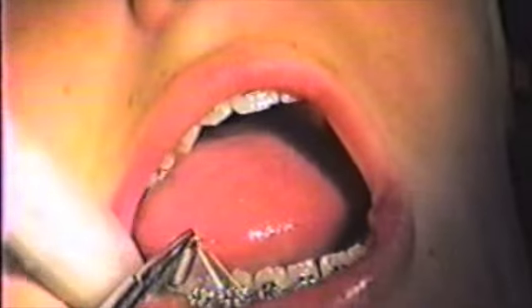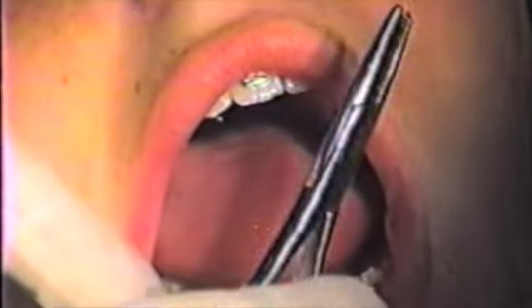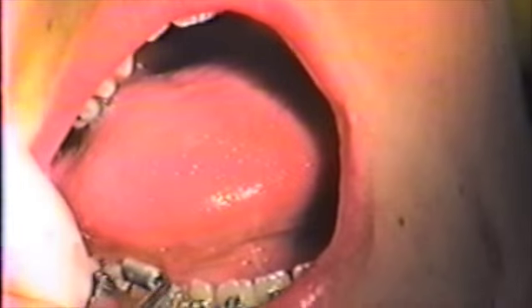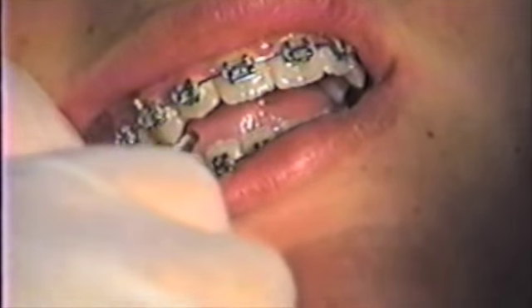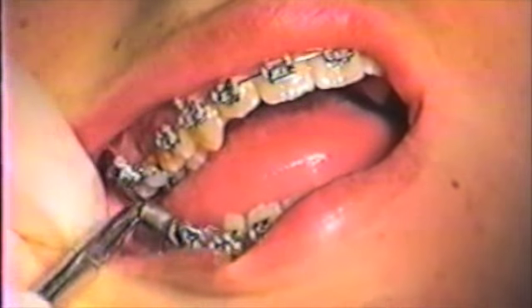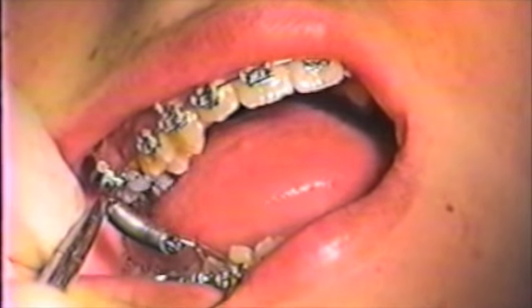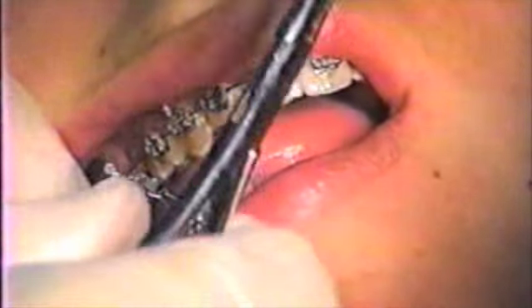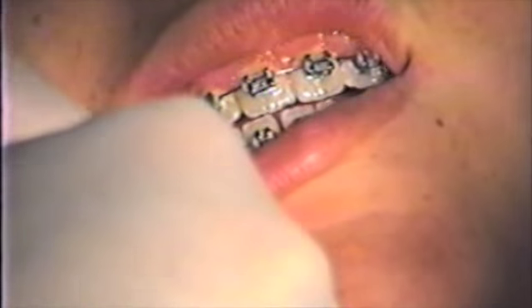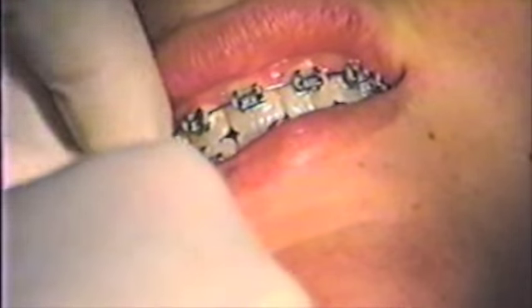The forces on a safe spring can be on the high side, usually 10 to 12 ounces. This amount of force will cause frequent breakage of brackets and band uncementation. Many patients will complain about the safe spring, and it is therefore undesirable to use in all cases, but it can be helpful in overcoming patient cooperation problems.